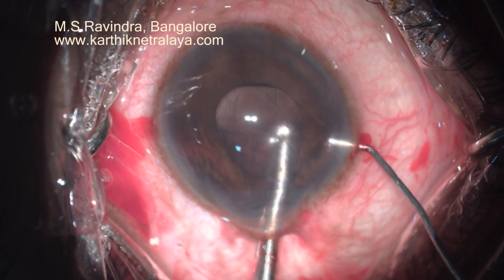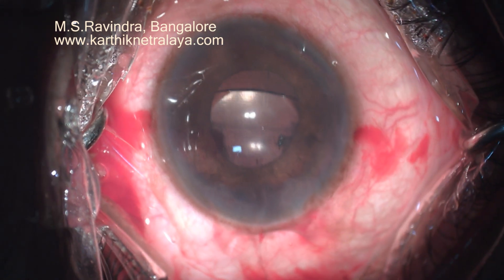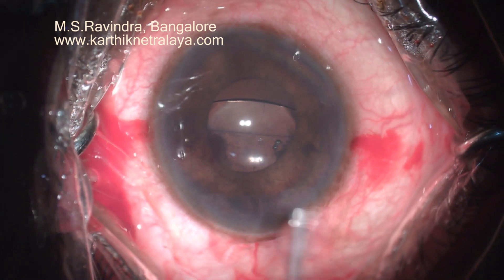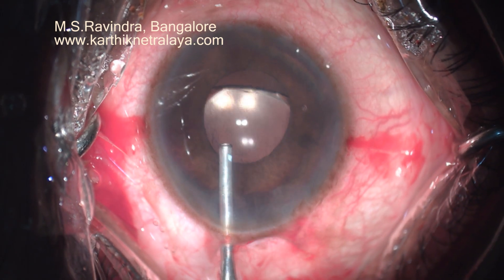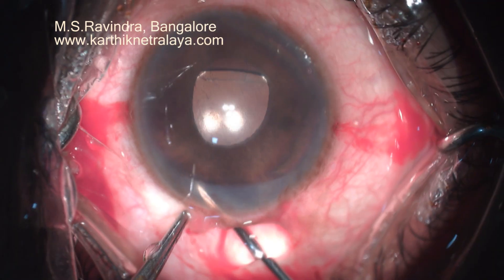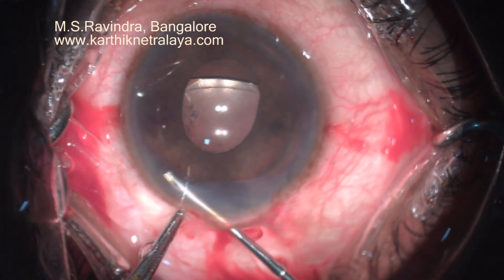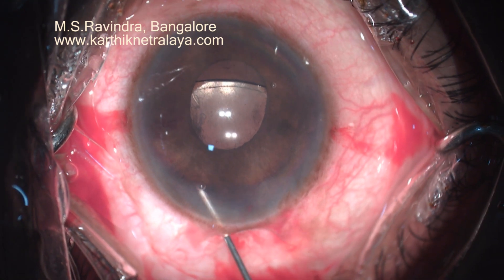Now I am doing an iridectomy with a 23 gauge hypodermic needle. The hole was enlarged with the cannula, confirming that it is through and through. Viscoelastic is completely removed from the eye and that is the end of surgery. There is no need to bandage the eye. I can start using eye drops, which includes homatropine eye drops and frequent steroid drops immediately post-operatively.